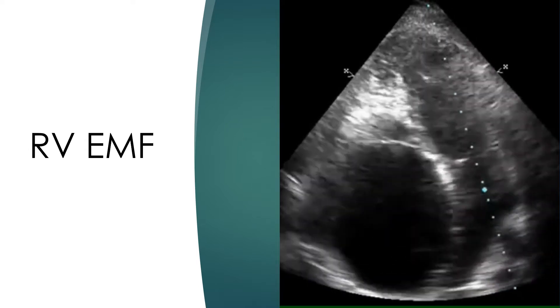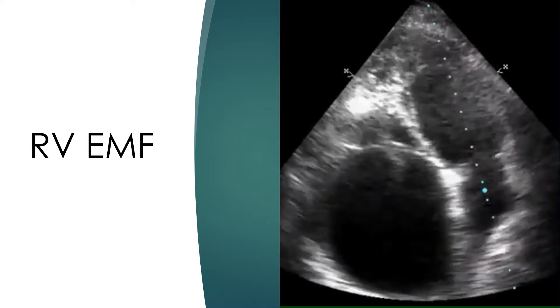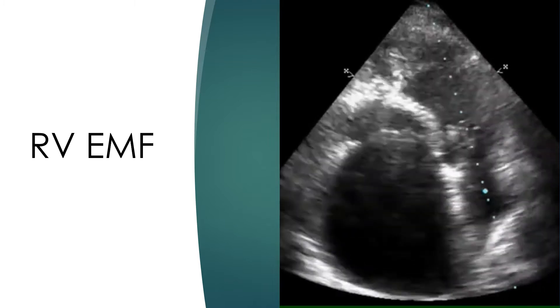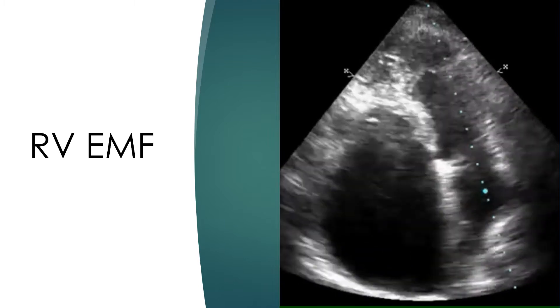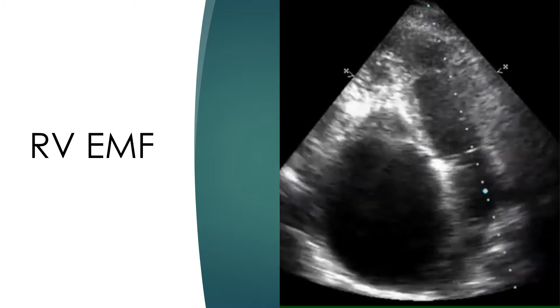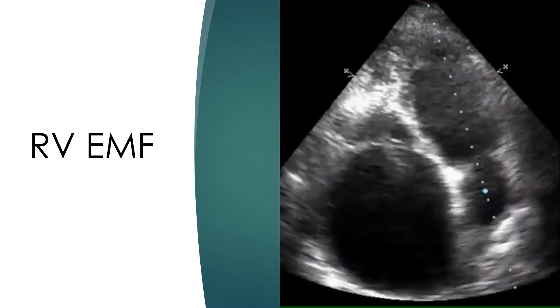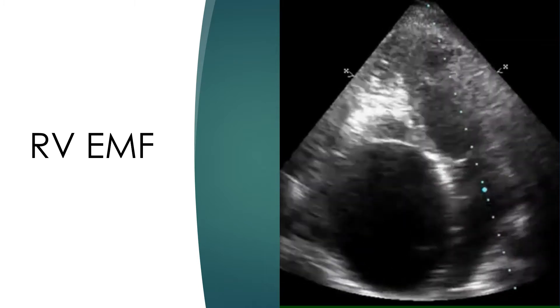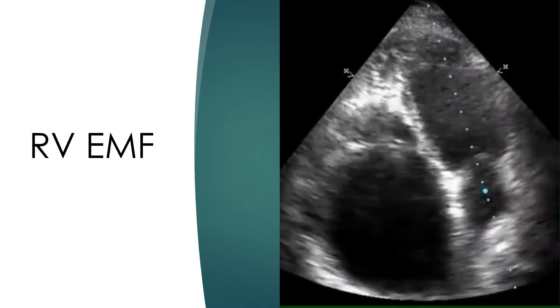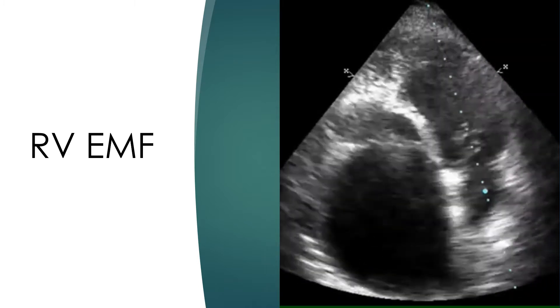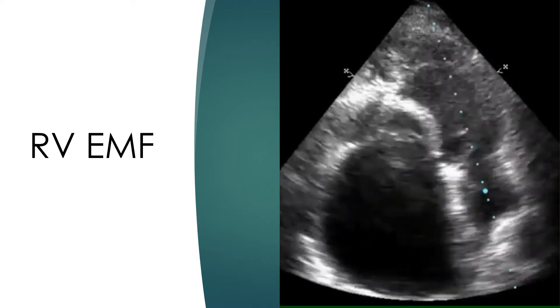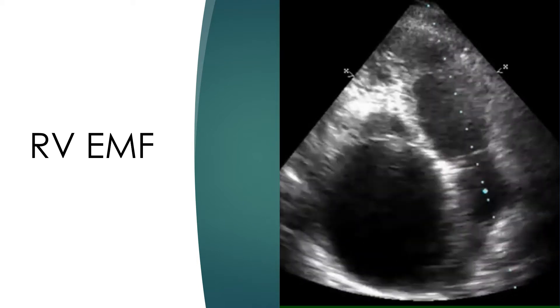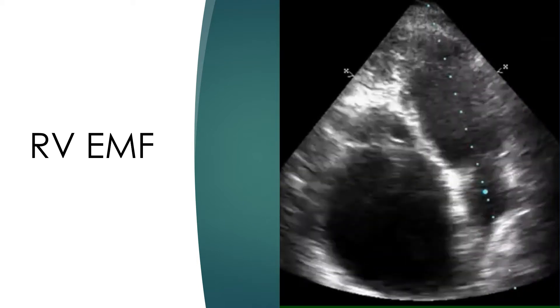Echocardiogram in apical four chamber view demonstrating salient features of right ventricular endomyocardial fibrosis. The right atrium is grossly dilated and the interatrial septum is pushed to the left. The left ventricle and left atrium are normal, though the left atrium appears compressed by the huge right atrium.